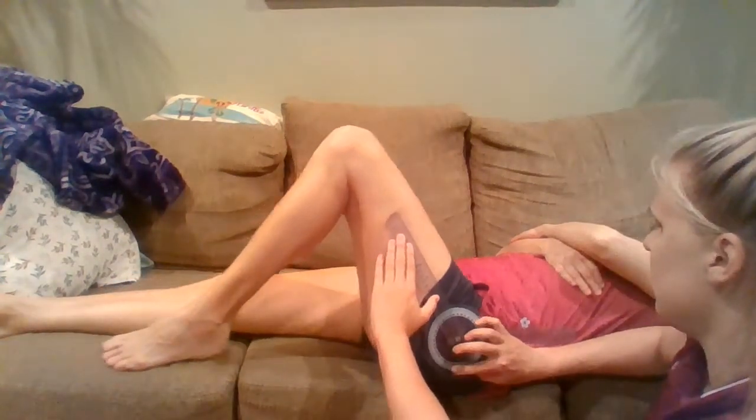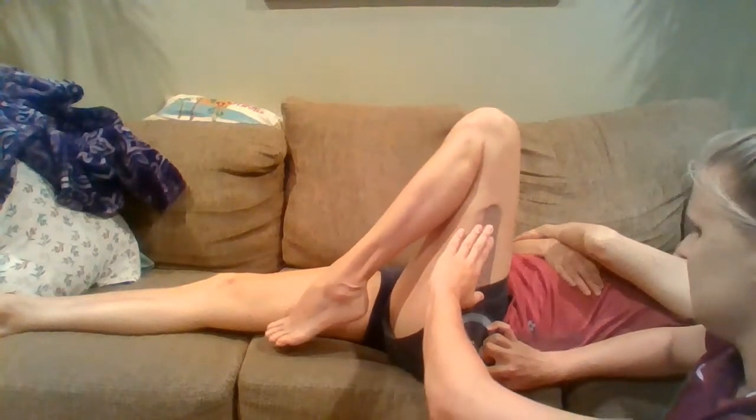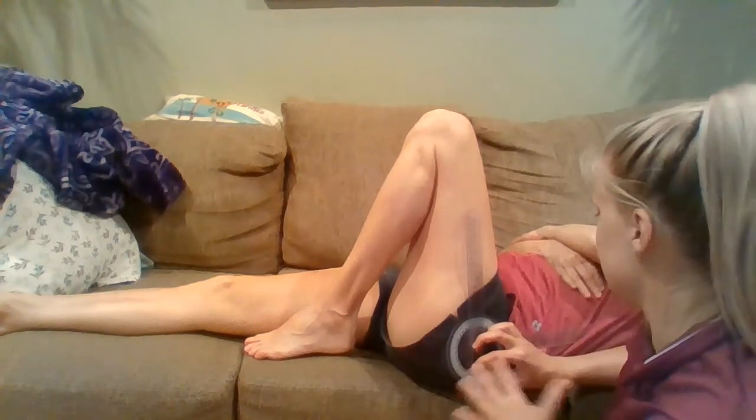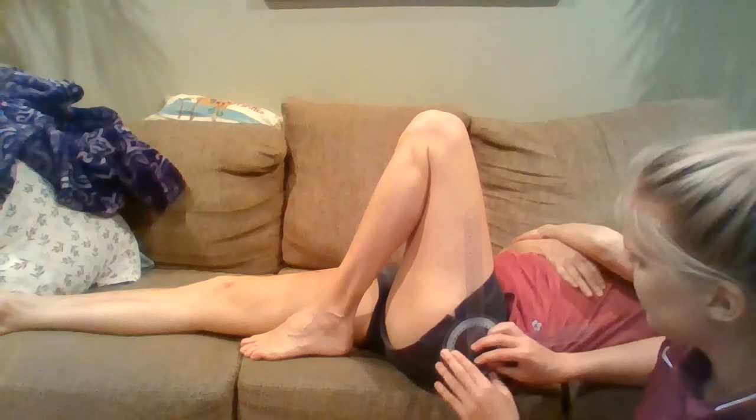Go as far as you can, bring your knee to your chest. Alright, can you go any farther? Alright, right there. So I'm going to stop her right there because I feel her pelvis wanting to tilt, and that is going into pelvic rotation and lower back stuff, and that is not measuring hip flexibility. So we're going to stop right there. We're going to look at the goniometer, and the goniometer is right at about 90 degrees of hip flexion, and that is on her left hip. We will do the same thing for her right hip.